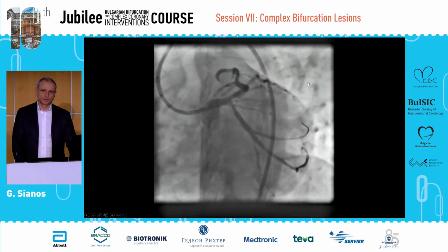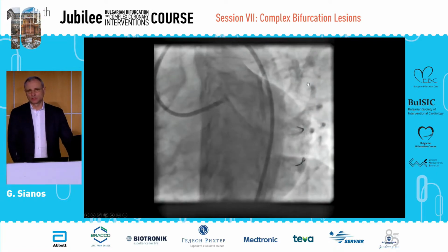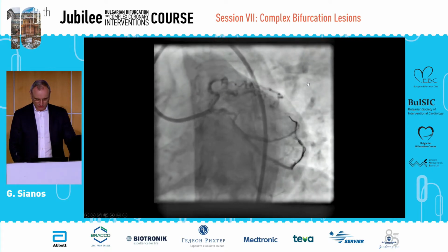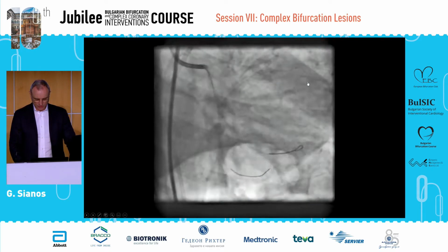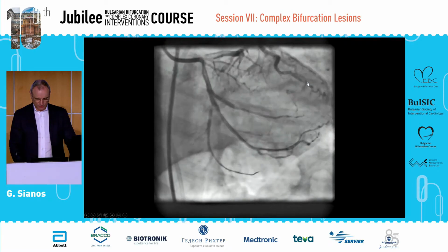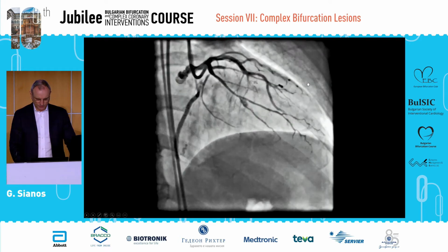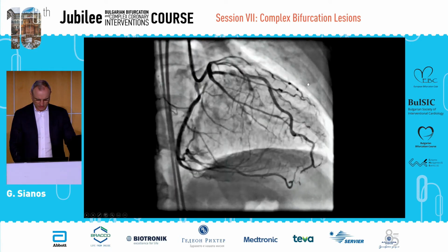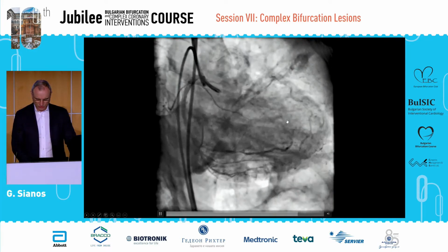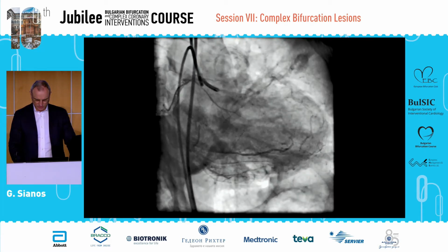It shows how the complexity can be really increased by having, in a bifurcation lesion, one vessel accessed antegradely and the other accessed retrogradely, finishing with bifurcation techniques. And you see, of course, here the third branch also that was involved in this case. So it's a little bit of a double bifurcation. All branches were rescued. Final result in this case. You can appreciate that here. You can see also a small septal rupture. Thank God it was not epicardial.